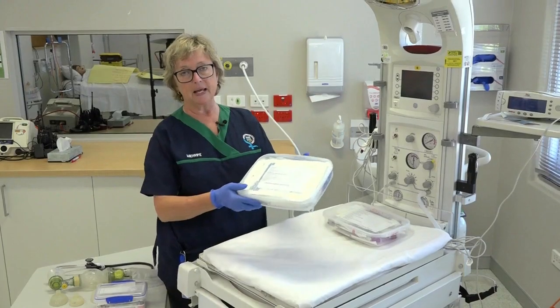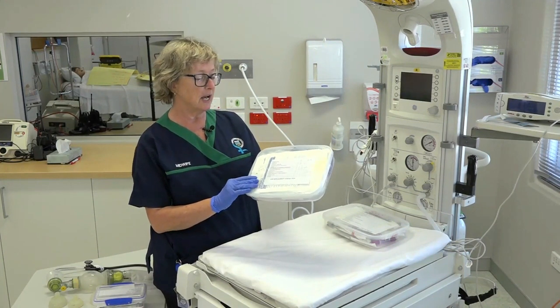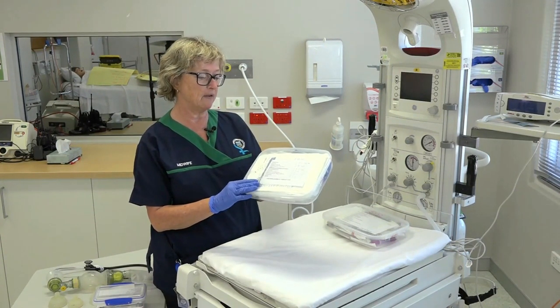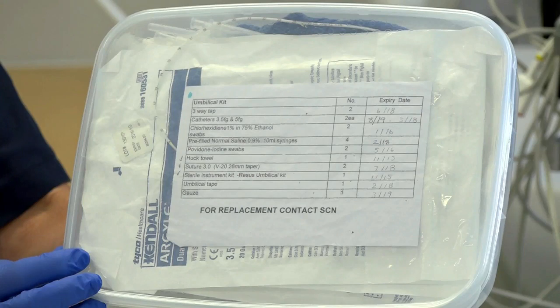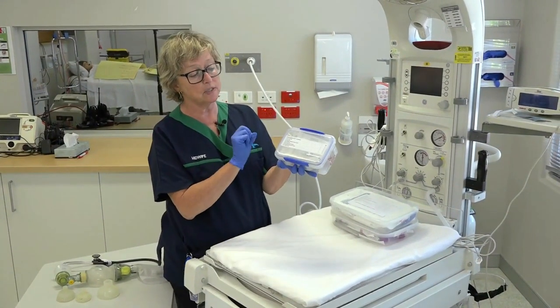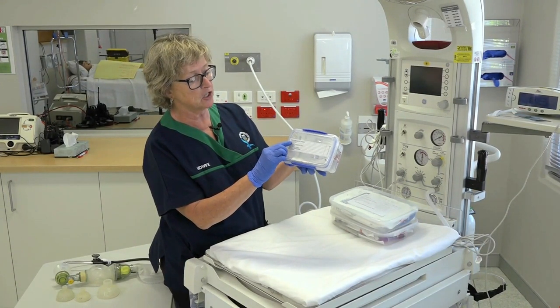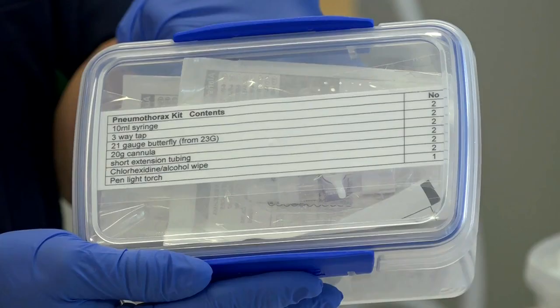The second kit is for umbilical venous catheterization, set up for an emergency. It has everything needed to perform a catheterization in an emergency setting. It has a list of what's included and needs to be sealed and dated so you know it's clean. Our final kit is a pneumothorax kit with two sets of items for pneumothorax aspiration — again labelled, sealed, and dated.